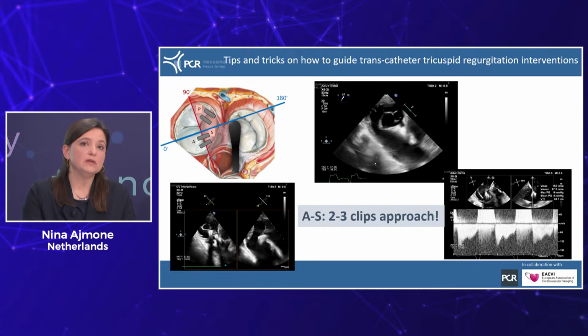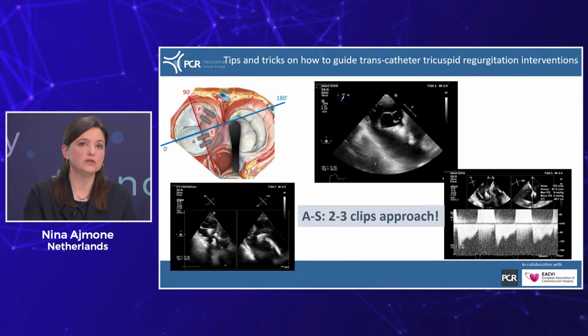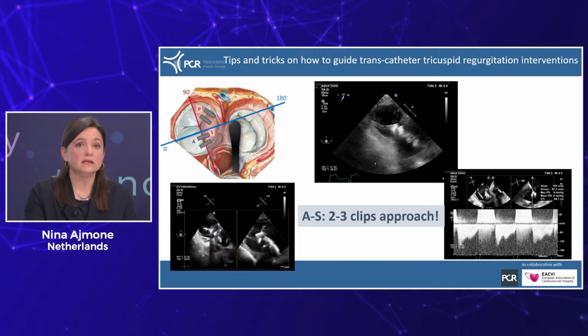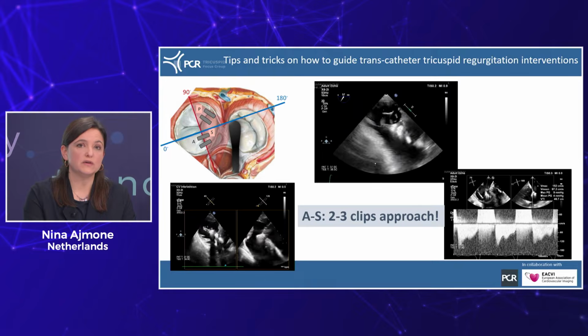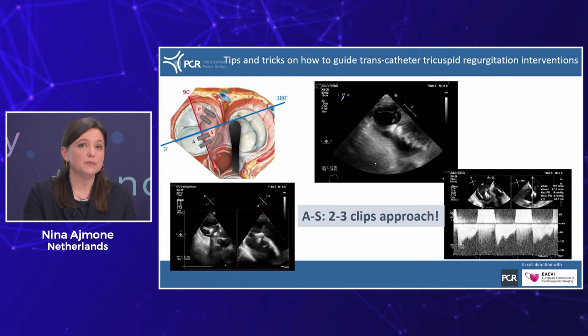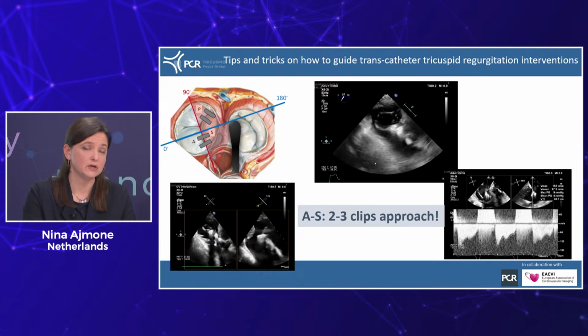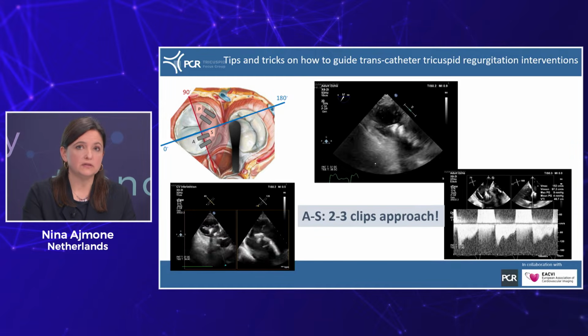And here, just below the schematic, you see exactly the same patient with the clip, first more into the commissure, another one more centrally. And in this case, as you can see, we reduce very much the opening. And I put another very extreme case in which we put 3 clips maximum in our center, and we did indeed induce a partial stenosis. So we always need to measure also the gradient, that in this case you can see was a mean of 4, still under the 5 millimeters of mercury, but for a tricuspid valve indeed quite a high gradient.